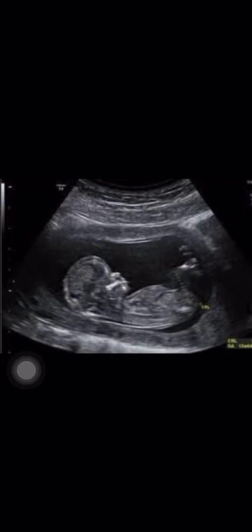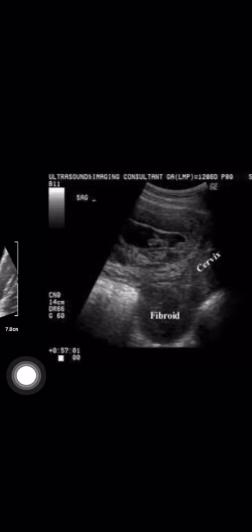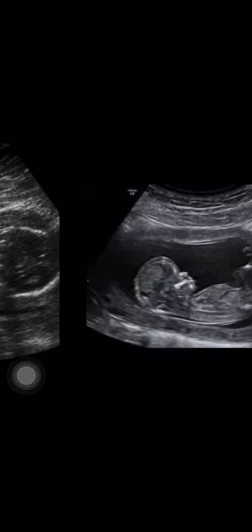So what are the roles of ultrasound in the second trimester? يعني the same مثل ما قلنا, راح نشوف number of fetuses, يعني twin pregnancy, triple pregnancy. Assessment of gestational age: عادة نقيس biparietal diameter. This is example of how the biparietal diameter is measured, or assessment of the femoral length.